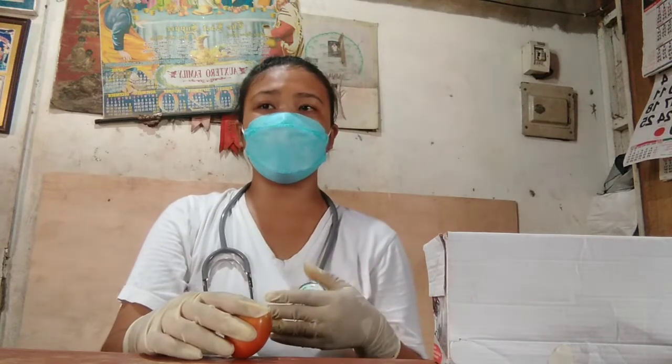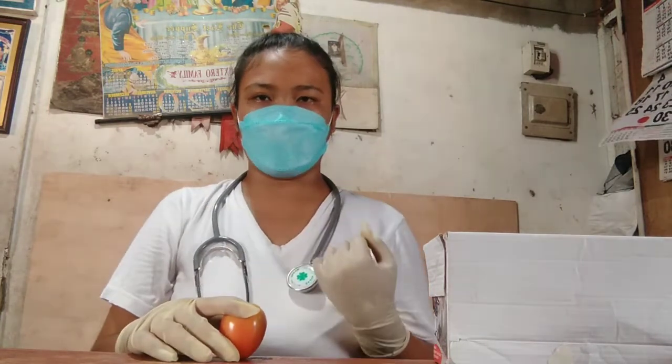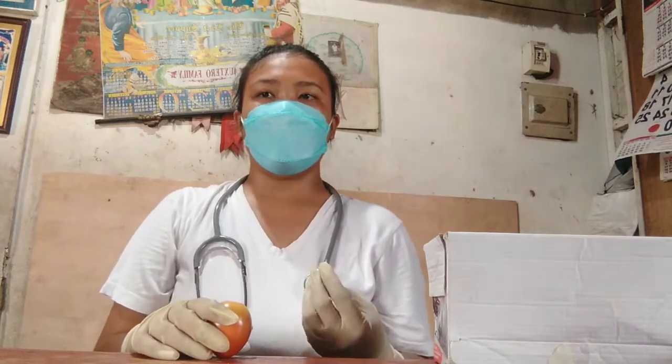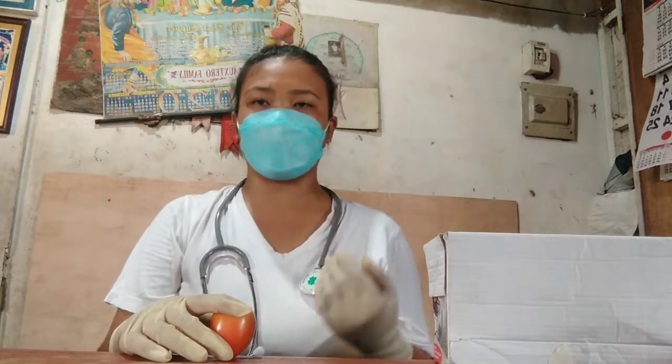Next, select a site free of skin lesions, tenderness, swelling, or localized inflammation, and one that has not been frequently used. Palpate previous injection sites where absorption was inadequate. Assuming that I'm done choosing a site, next is to locate the exact site for injection, to have the correct location and to avoid damage to tissues. Next, put on clean gloves. I'm done wearing my gloves, to prevent possible transfer of microbes.